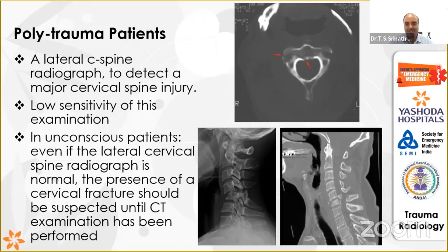You go with the patient to the radiology, try to pick up all these small elements, how you can detect the free fluid, how you have to look for the pneumothorax, how you have to look for the hemothorax. Those skills are a must today for all practicing emergency physicians. And the importance is, it is quick, it is easy.